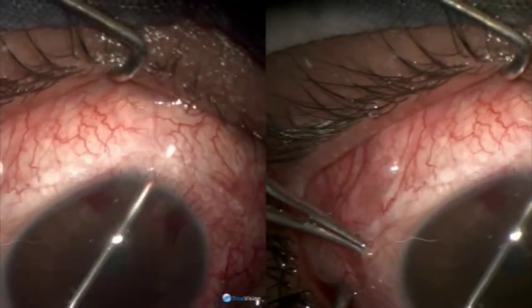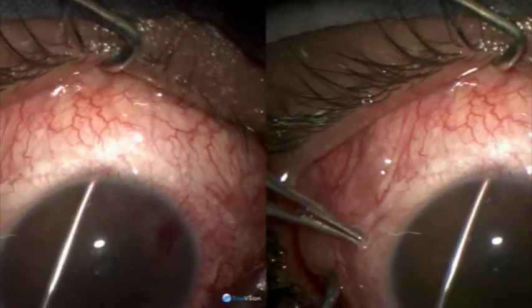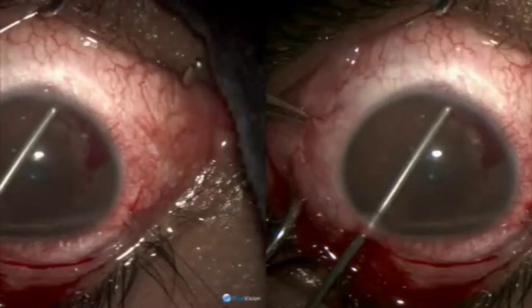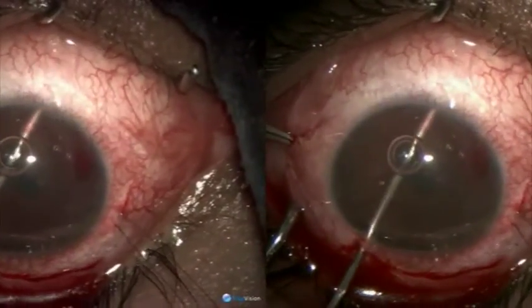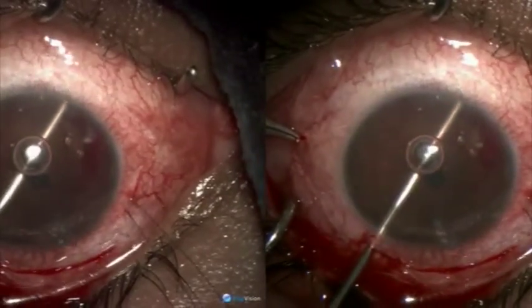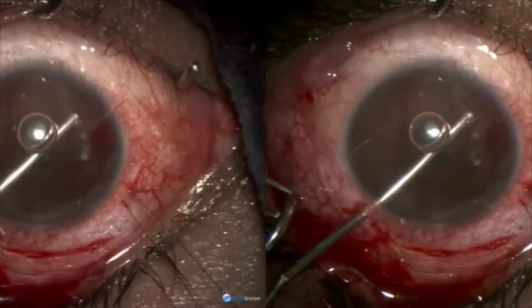Some bleeding is noticed, which is many times inevitable. Because of the scarring under the conjunctiva, there you find there is less bleeding. Now we are irrigating as well as completing cyclodialysis. The fluid washes out whatever free blood is there.